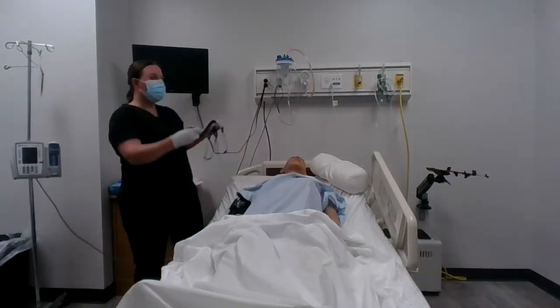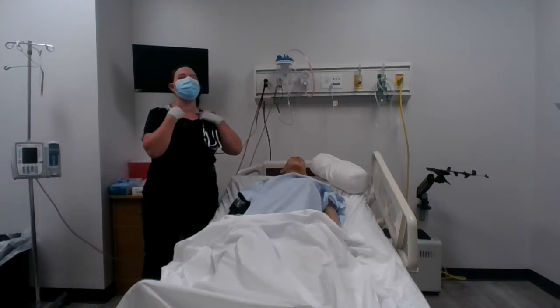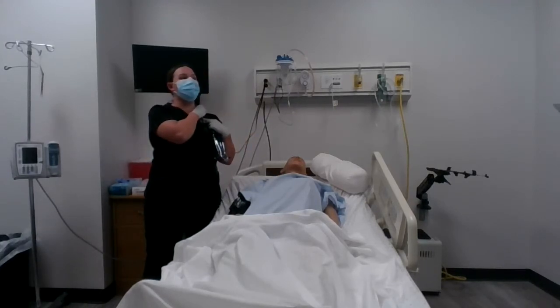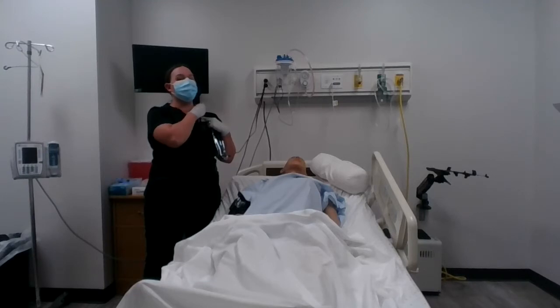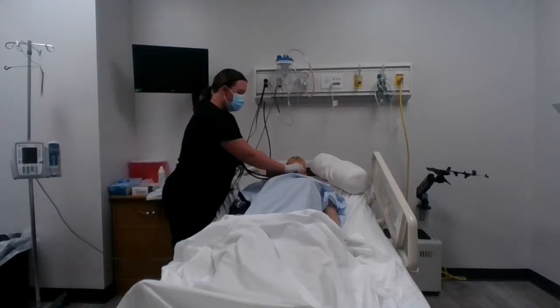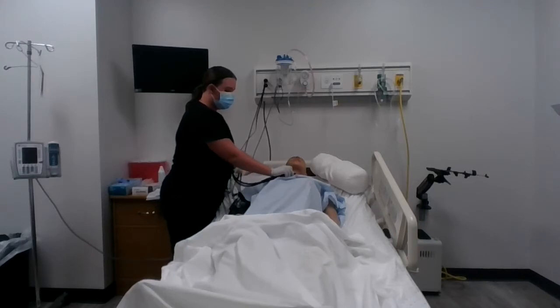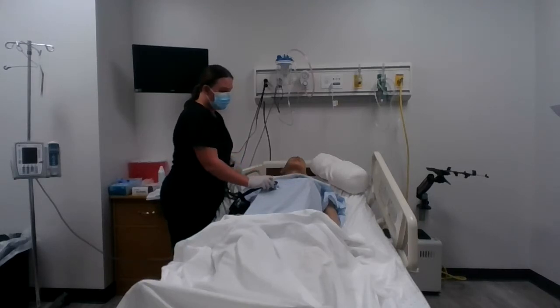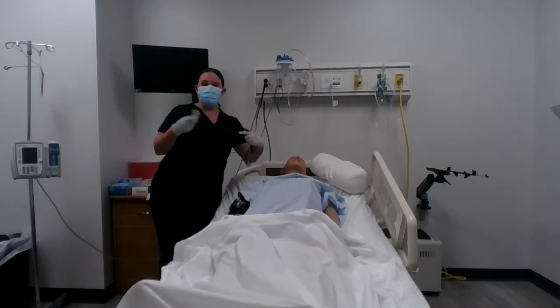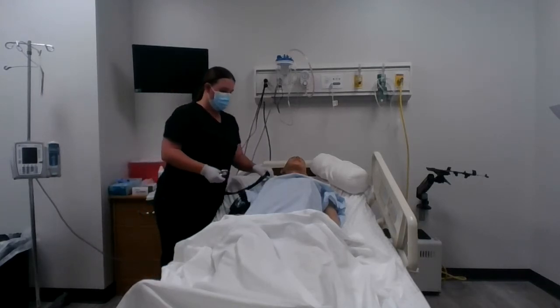You're going to listen to all ten anterior sites — the patient takes a deep breath every time you place your stethoscope. Count them out: one, two, three, four, five, six, seven, eight, nine, ten. You've got to hit all ten points.